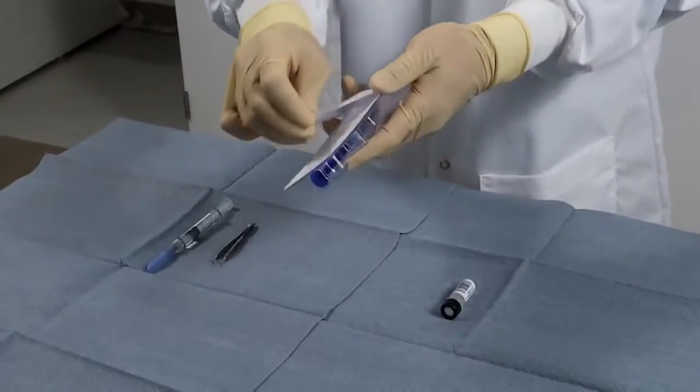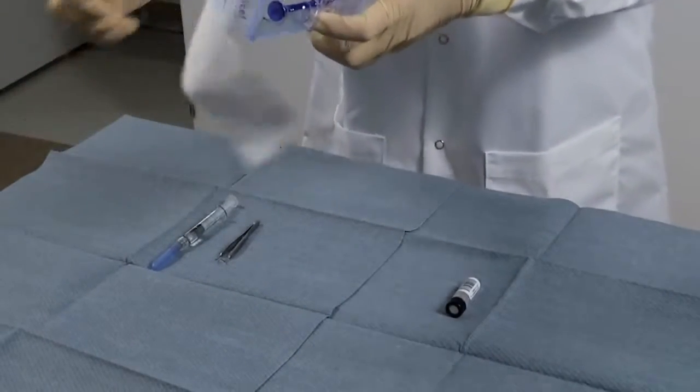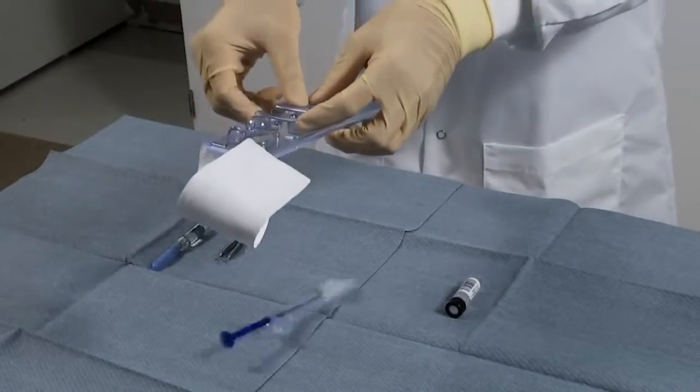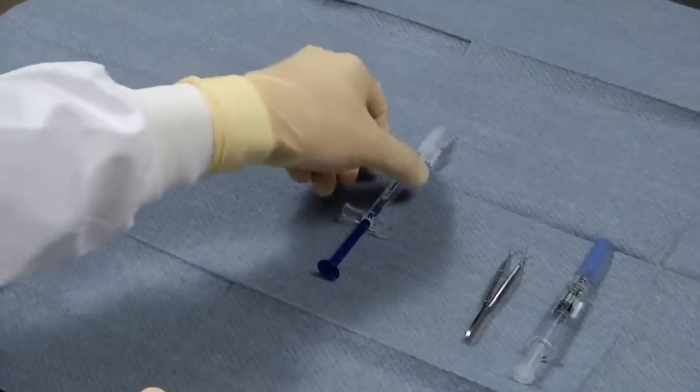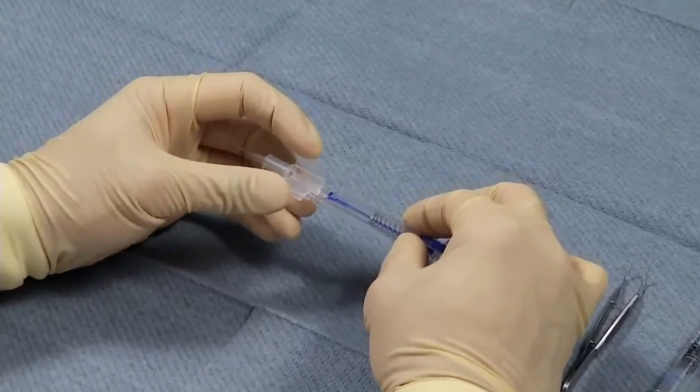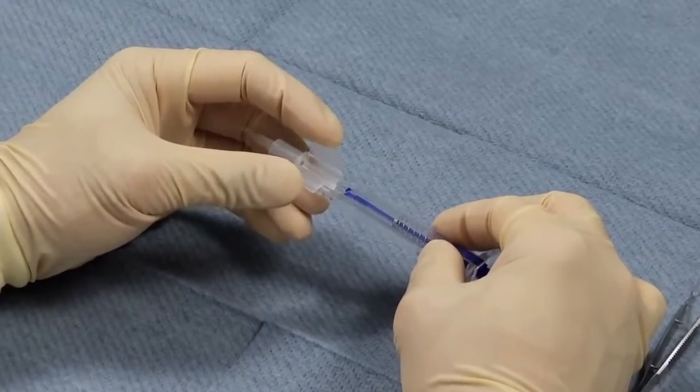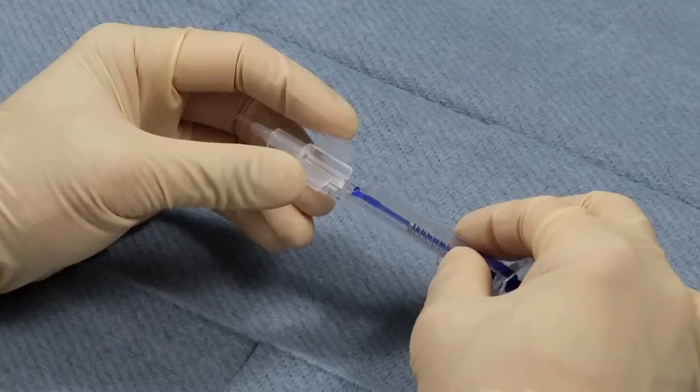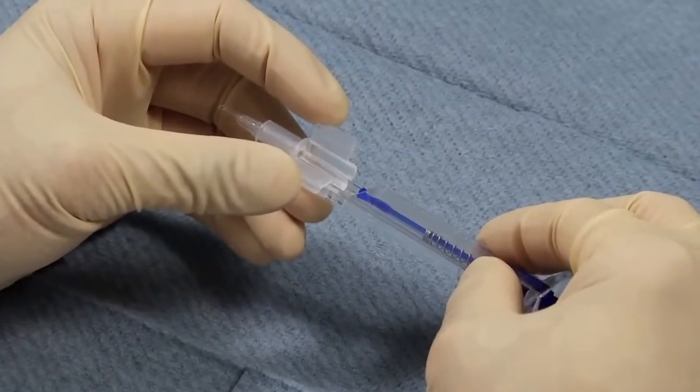First, open the injector blister tray and transfer the sterile injector onto the sterile field. Hold the injector in such a manner that the movable and fixed cartridge wings of the loading chamber can be guided with the index finger and thumb. Then, open the loading chamber.